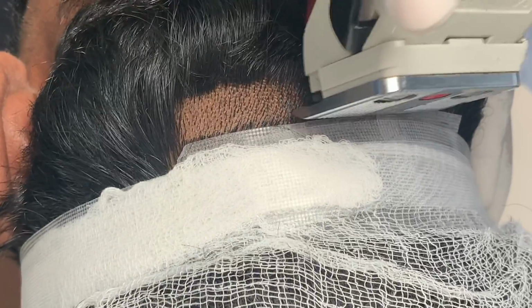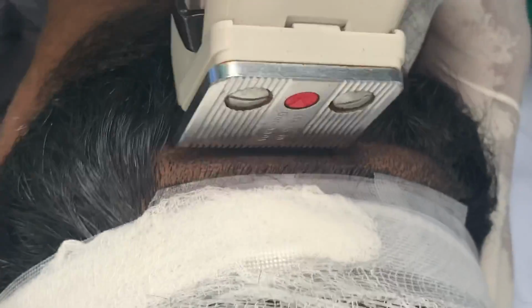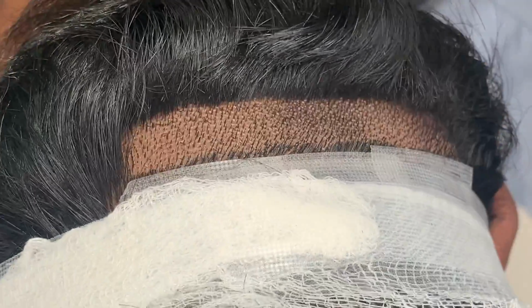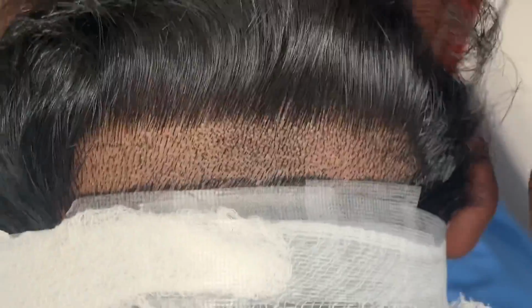So we're shaving some of the hair here. This is for preparing the donor area. We will be harvesting the follicles from this area, and I use those follicles in the moustache, making a small window like this so that once you take the tape off, it's not going to be visible, so the patient can go on with their normal life.